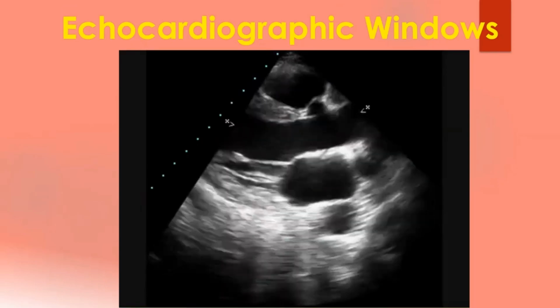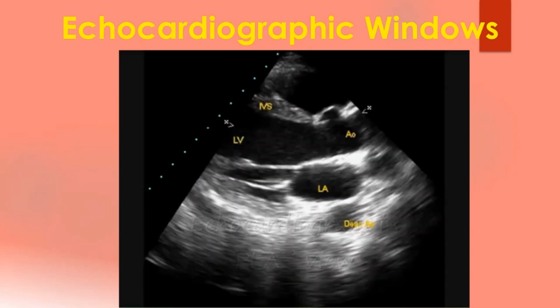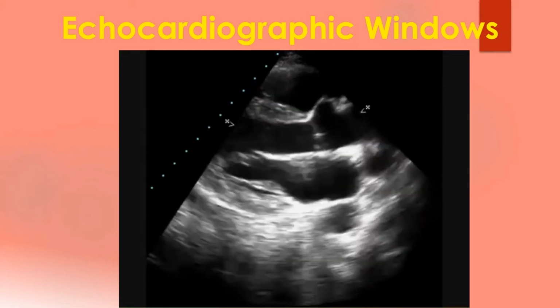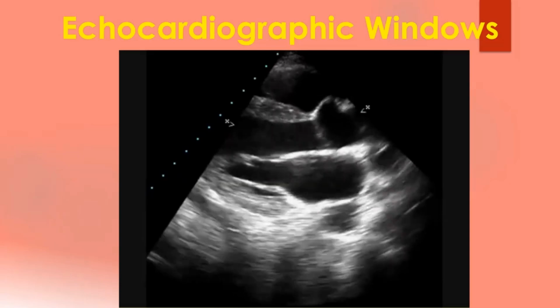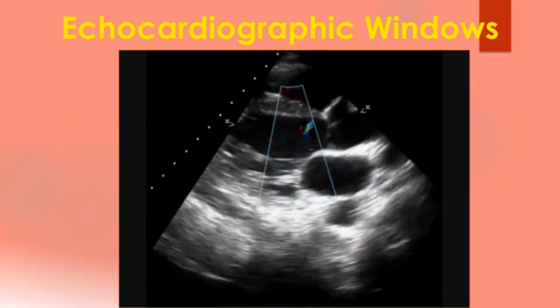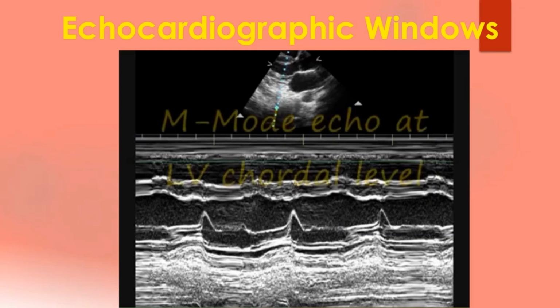An annotated video of normal color Doppler echocardiogram illustrating various views and an M-mode tracing is shown here. Initially, there is a two-dimensional view from parasternal long axis view followed by color Doppler and M-mode. Parasternal short axis view, apical 4-chamber view and suprasternal view follows.